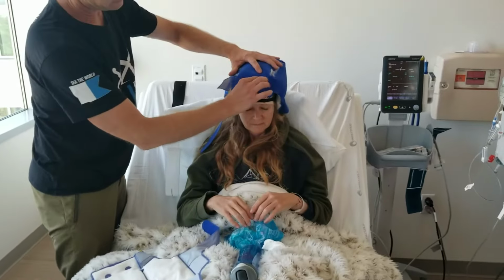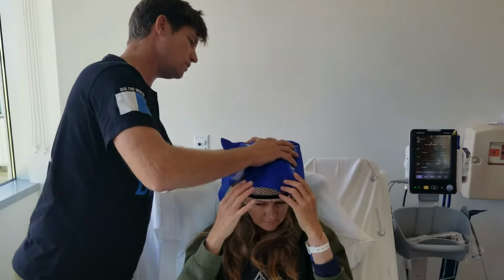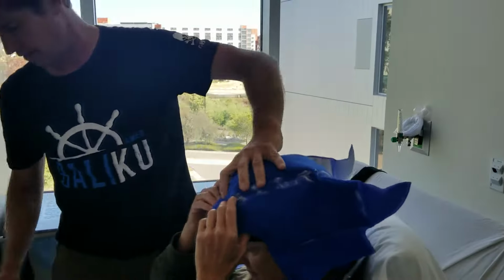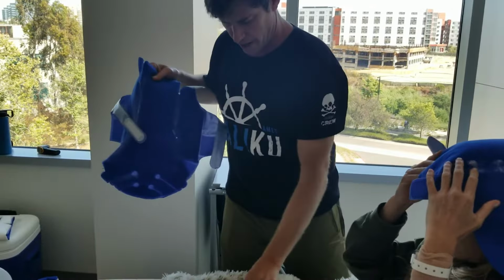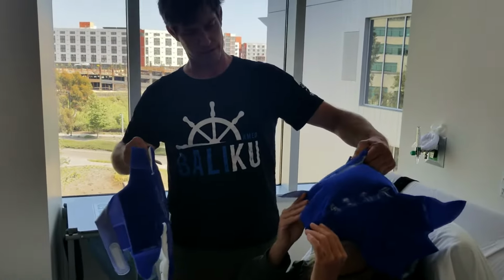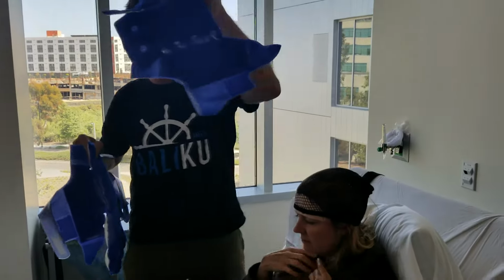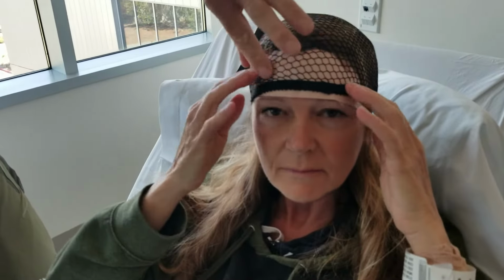I loosen the front and the back, and the key is you want to keep it cold underneath the head. Now I'm getting ready to do this, and you see things where they say do the chin strap first. You really don't even need the chin strap if your helper does it. So you take it off. As you notice, she's got a hairnet on. I highly recommend that. Also, this is moleskin on the front.